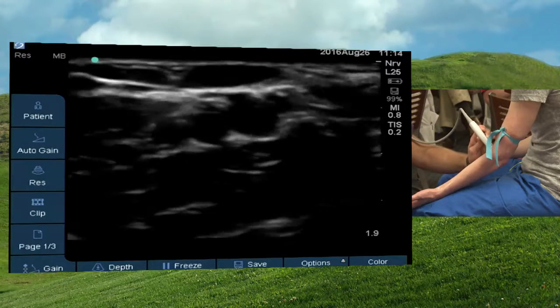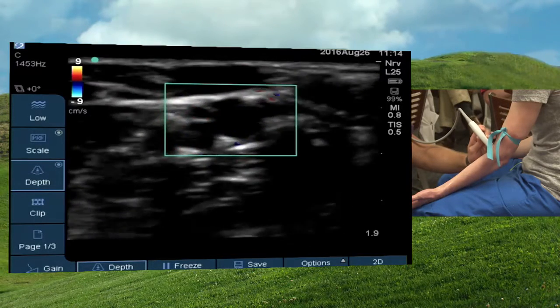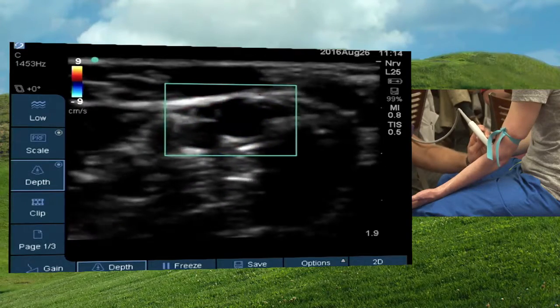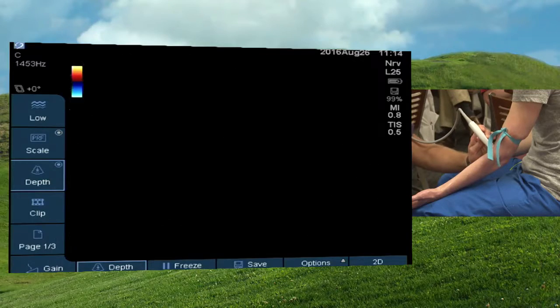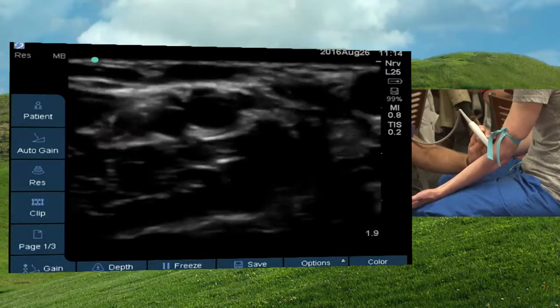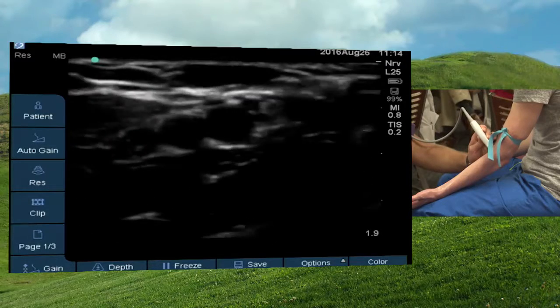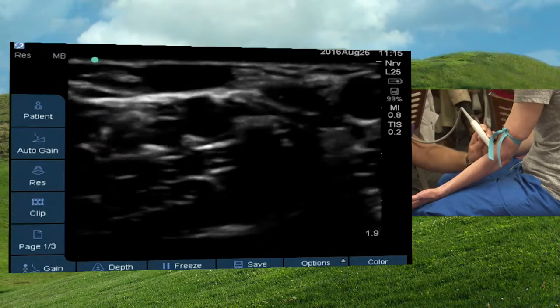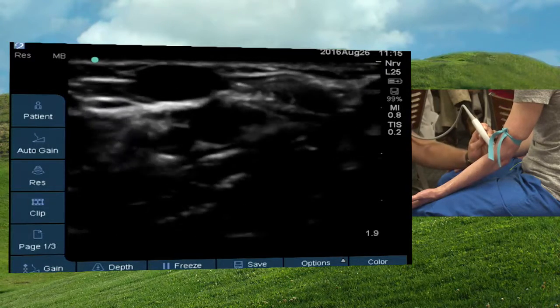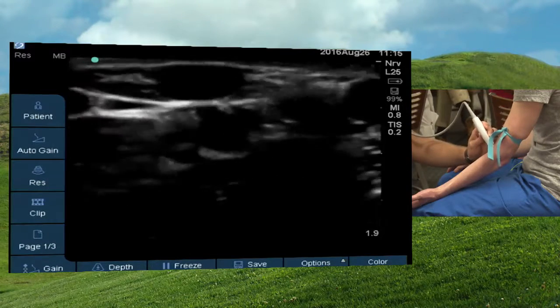And actually, we can look a little bit deeper here, and I'll put some color on it. There's actually an artery, so it's very interesting to look at these. So we have a vein there on the very top, and an artery just directly beneath it. And I'm going to apply pressure, and this is interesting because we can see how much more easily the vein crushes relative to the artery. So this is one of my favorite things to do when I get called on a patient who's a bad IV stick. Nursing likes to use the ACs, which drives the anesthesia crazy, and that's okay, but if that's what you got, that's what you got.